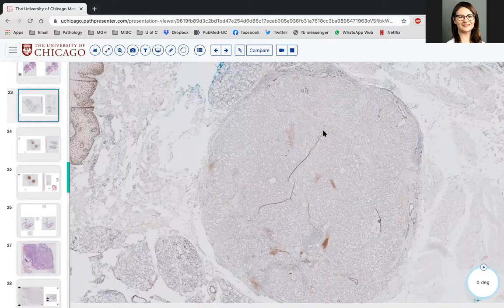Because it was sort of new to everyone, and we had ETV6 FISH from our other fibrosarcomas and other neoplasms. So we were doing the genetic studies in the early days, but after getting a handle on this diagnosis with morphology and immunostains, we stopped doing the FISH, because you could really make a diagnosis based on the morphology and the immunoprofile. But the FISH in this case is out there.